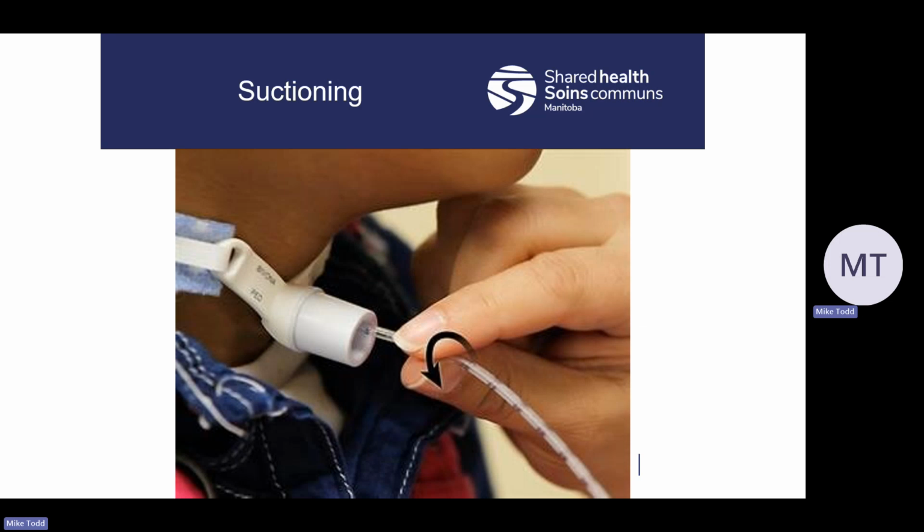Again, just like when we suction the oropharynx, we're always worried about causing more hypoxia. The patient may not be able to breathe. It's actually recommended to try and do suction while the patient is exhaling.